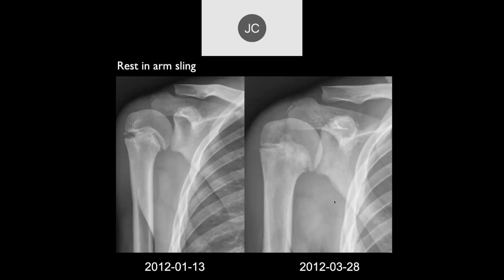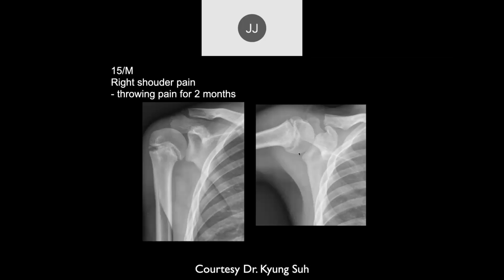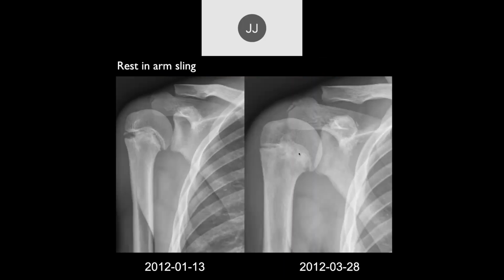Okay. So this is that same patient. Here we can see this is January 13th, 2012. This is March 28th, 2012. Supposedly he's resting between these in a sling. What did you think? So it looks like there's narrowing of that physis now. Looks like there's almost sclerosis across that physis there. So there's some bony healing in this particular patient. It looks like it's fusing. How old is the kid by now? That's a good question. Let's see. 15, so probably he's close to the end of his growth. He's not going to grow much, so I don't think that's going to be a big deal.